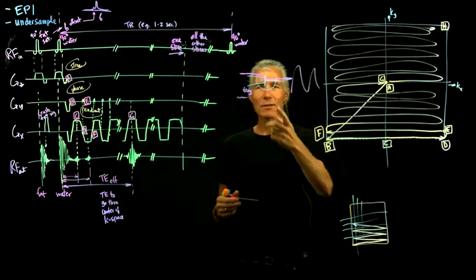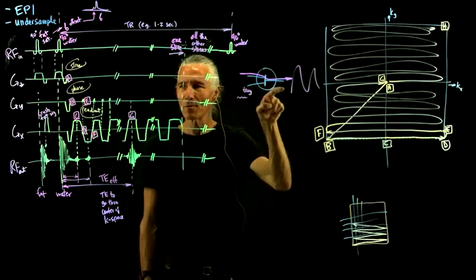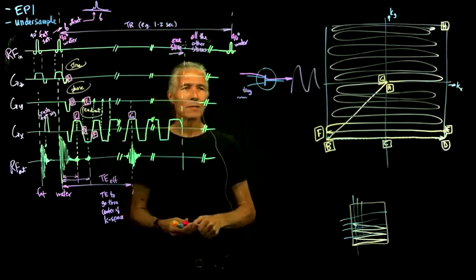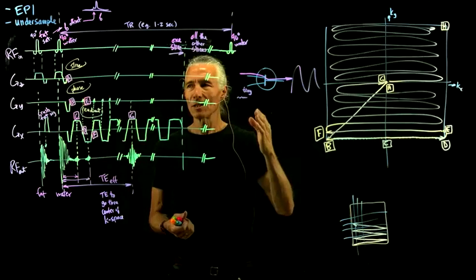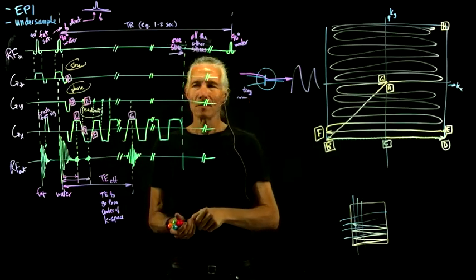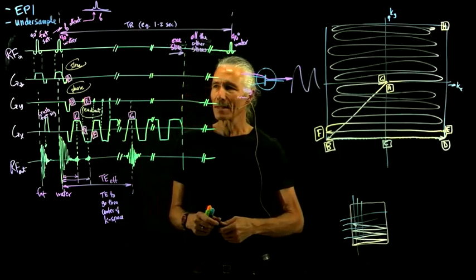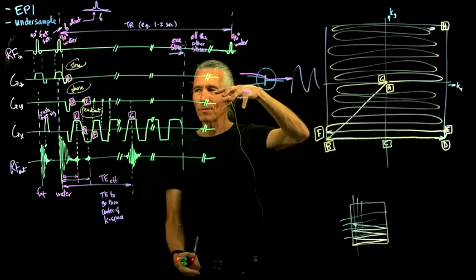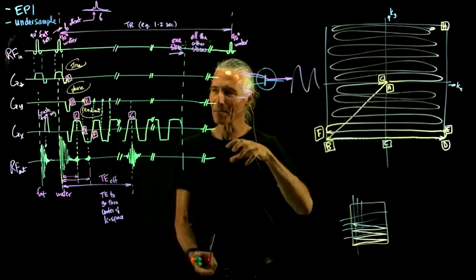And if you use a transistor like that, there's limits on how much power you can run through the transistor. So it turns out there's another way to make the transistor work, which is just to make it work as an off-on switch. And if you do that, it's possible to run a lot more current through the transistor. And that's the way the amplifiers that we have now work. And that's why you can get a 1,000,000-watt amplifier into a little container this big. It's water cooled because it gets quite hot.